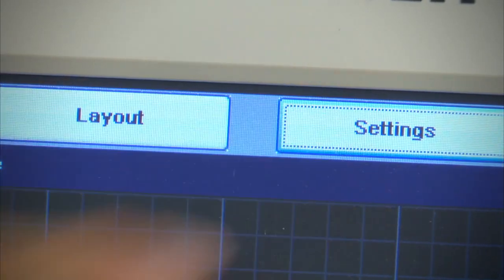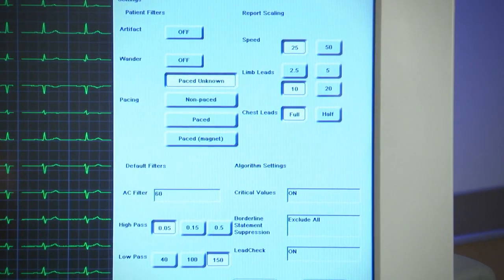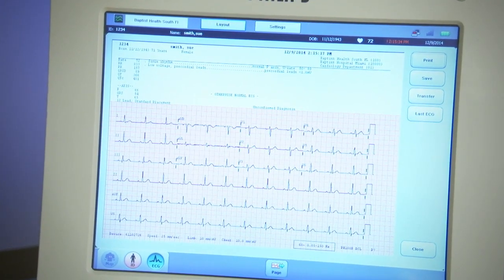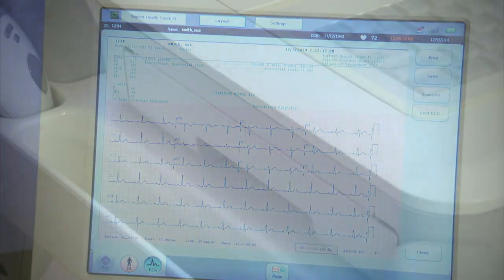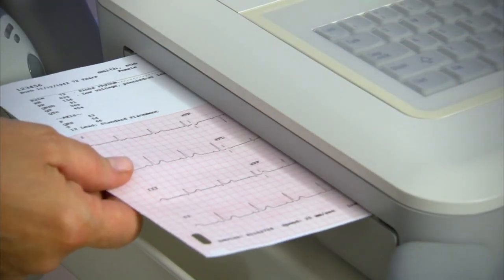Filters, lead selection, paper speed, and gain may all be changed on the fly if necessary, but the cardiograph default settings will automatically reset for the next patient. See how the changes are selected — this will result in the printed ECG. Now you have your 12-lead with three rhythm leads. Step 3 is to touch the green ECG icon.